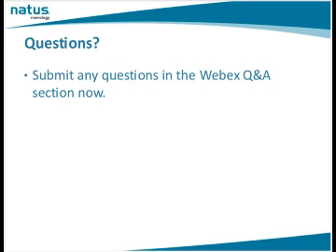So a big mistake that people make is when they're trying to locate the MCA, they will choose the signal with the strongest waveform, not the highest velocity. So you need to choose the highest velocity, even though that signal may be a little bit weaker, and trace that. Because if it won't trace, again, you're either on the terminal ICA or you're on a branch. And so if you're on a branch, you need to go back and maybe try a different approach.